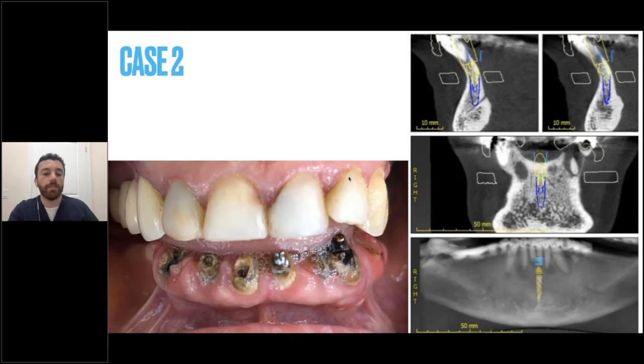Often you encounter these cases with what we call an hourglass-shaped mandible. And you can see that if you start to plan your case on the right side, your implant positions relative to the teeth are going to be quite lingual. So when you design the case, you actually have to bring your teeth positions back to where they used to be. So you have to use multi-units to basically tip everything facially. So if you were to do this freehand in the mouth on the day of surgery, it would be very hard to guess these positions.